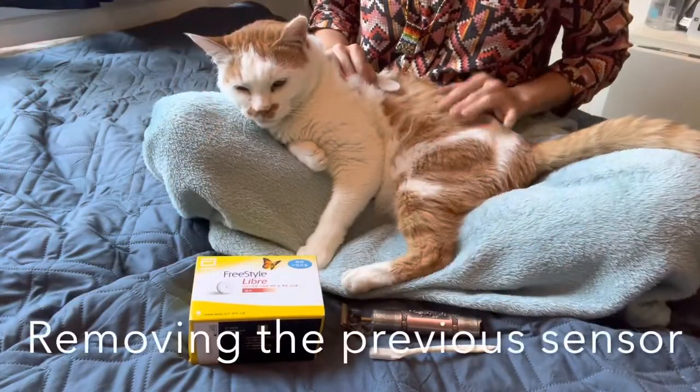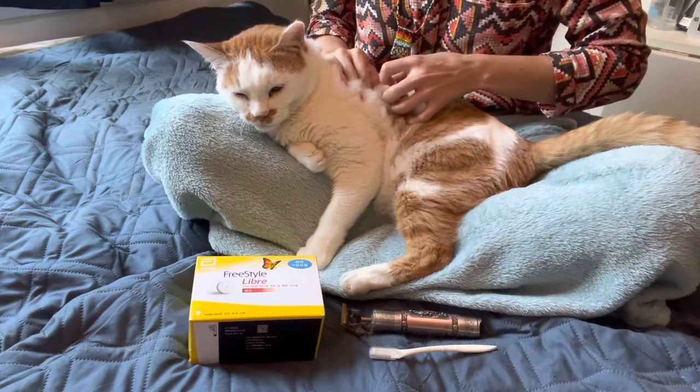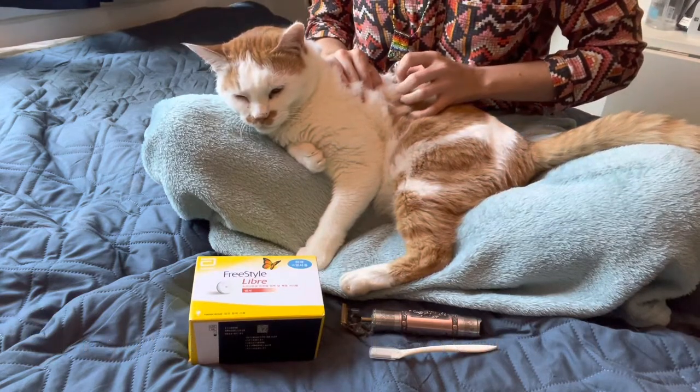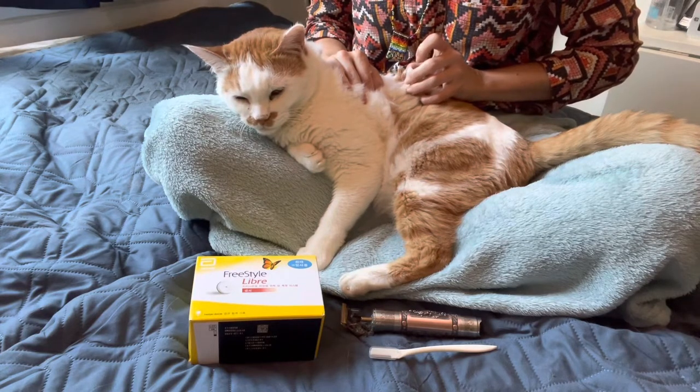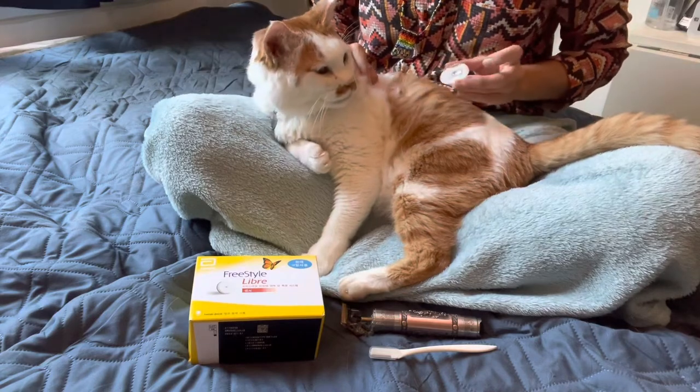This sensor was on for two weeks. I'm just going to gently lift the sensor and pull it off. There you go, buddy. Ready?